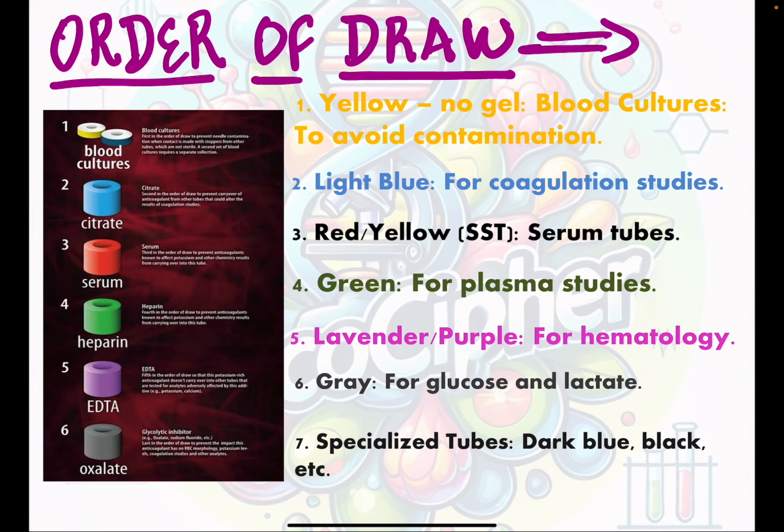Now, this topic is important as an exam going student for your competitive exams, a pathologist, as well as a physician. And most importantly, even the general public should have knowledge of it. So y'all must know what this is. Y'all must know the order of the draw of blood in it, and the colors, what additives are used in it, and what their uses are. They will be asked in your exams, and also spread this knowledge to everyone you know, whether in the medical field or otherwise.